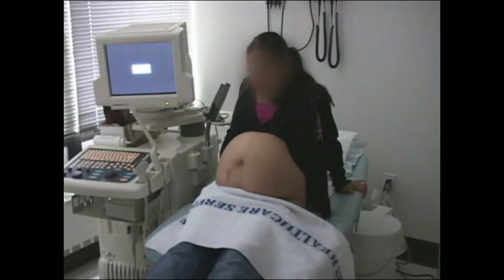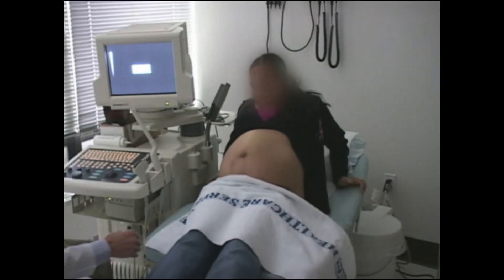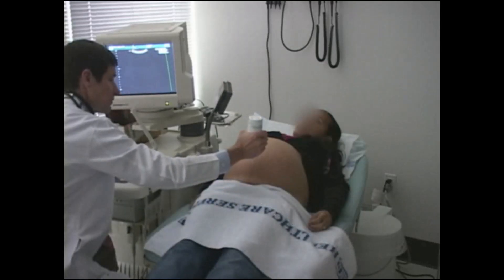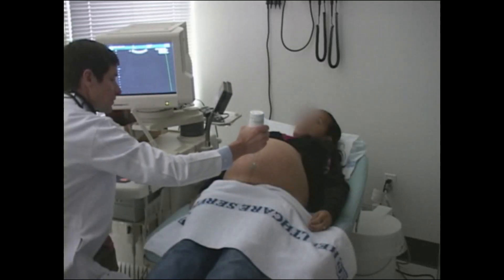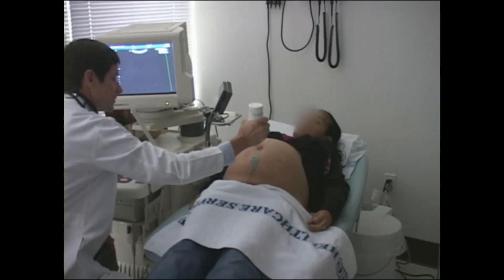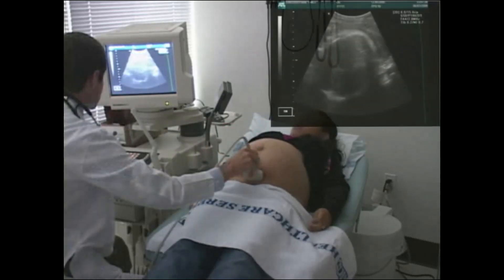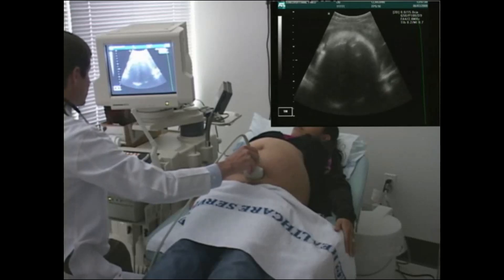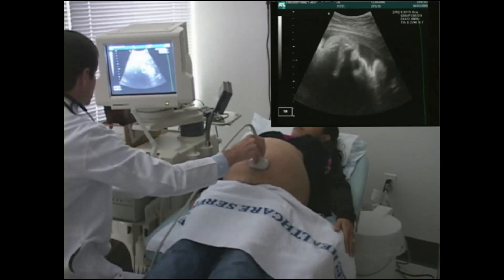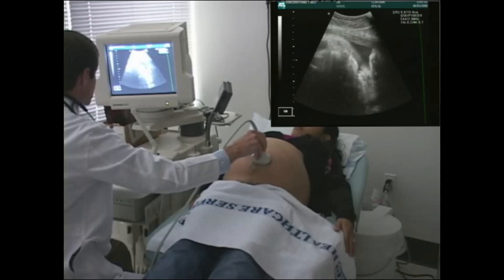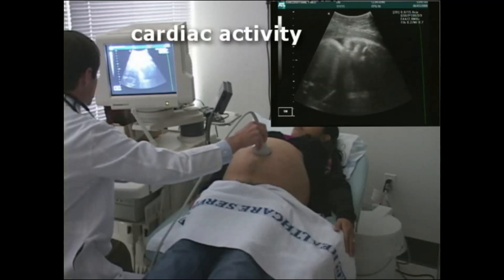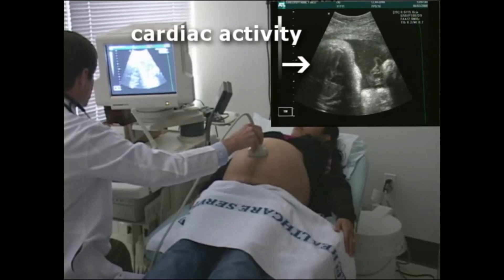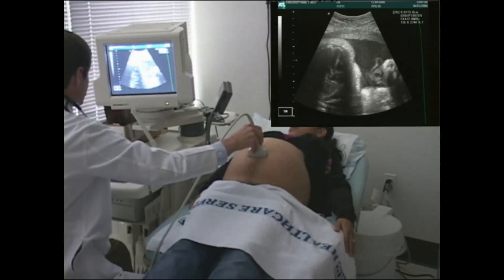Have the patient lie supine in a comfortable position with a pillow under her head for comfort. Liberally apply transducer gel to the mother's abdomen. First, briefly sweep the entire uterus to check for multiple gestations. Then confirm fetal viability by identifying fetal cardiac activity. Use slow, repeated passes to identify the fetal structures.